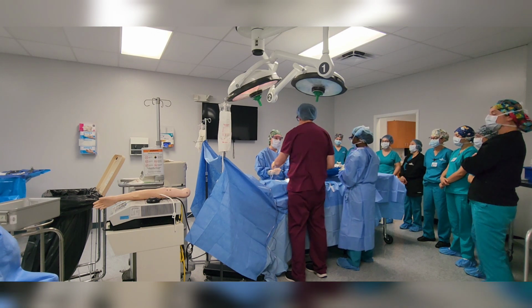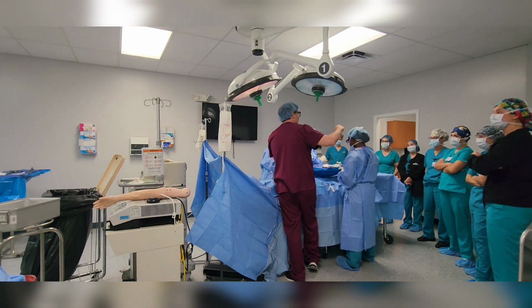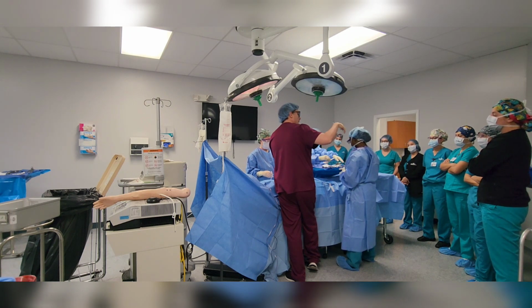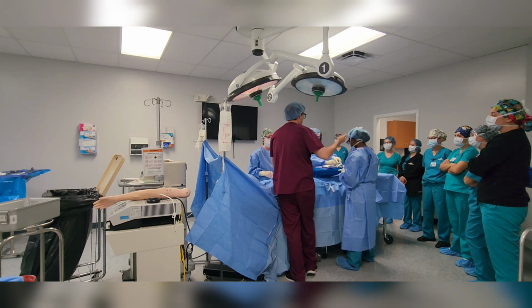The reason is you have to use both hands, because you could be holding a retractor with one, and the doctor says take it off. You can't let go of something, so you have to have the ability to use both hands. That comes with time.